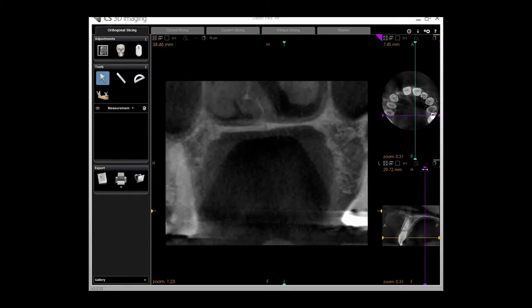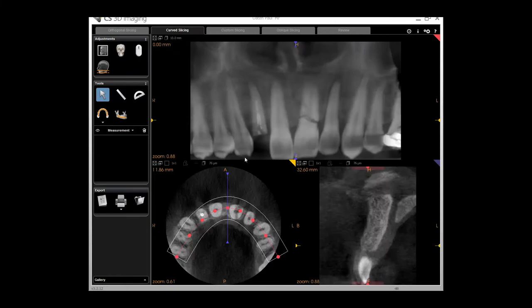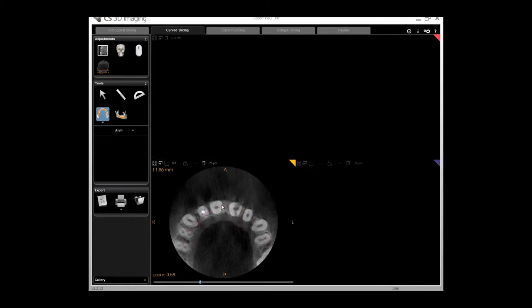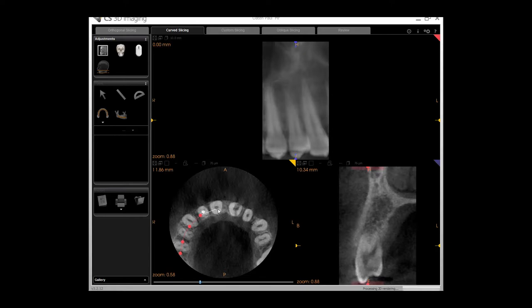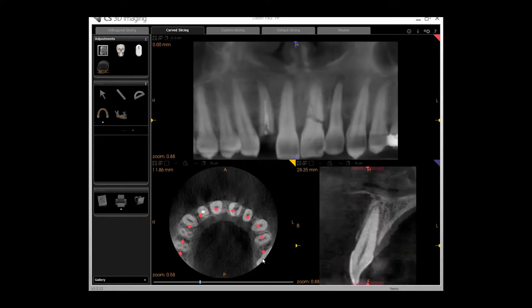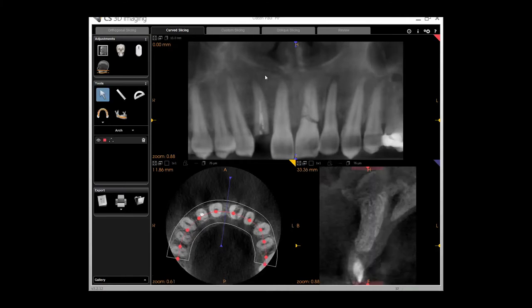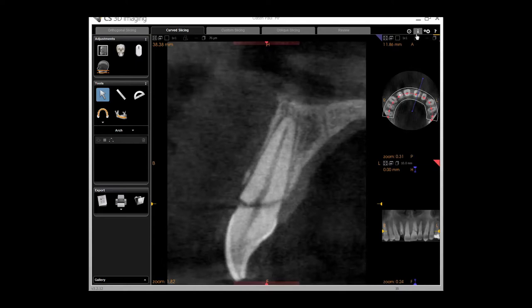I've closed that box back down now. We'll look at the scan more completely in MPR to make sure we can see the sinuses, the floor of the nose, and the areas of MPR which is useful. The second screen is a curved scan. I'm able to set my own curve here, which is different to some scan providers — I would just delete the existing scan by clicking the icon, then set my own arch. Single individual clicks along the arch, then a double-click at the end will finish it. I can then move the arch around by left-clicking and dragging it to where I want, giving me much more custom viewing than many other scan formats.